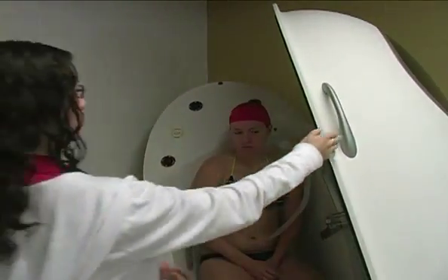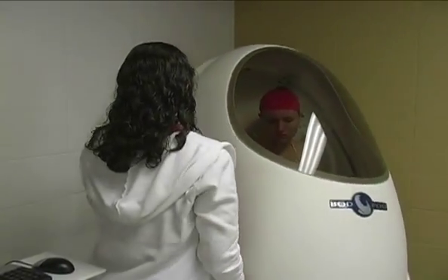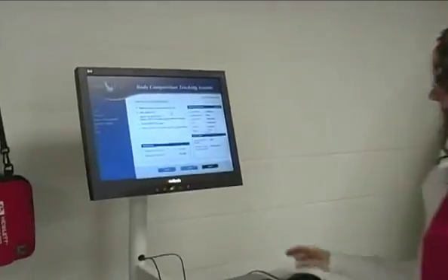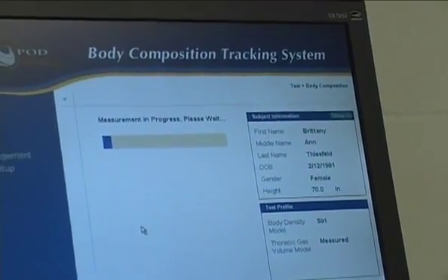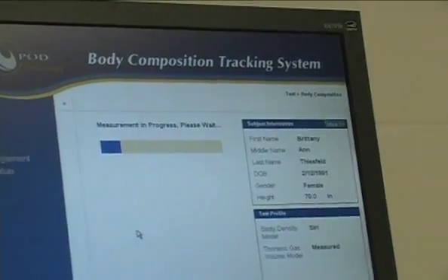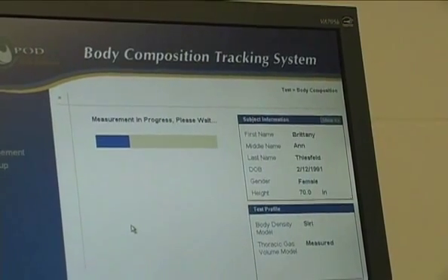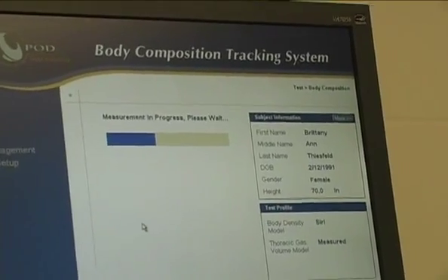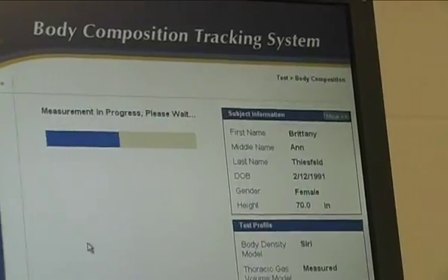So they've entered, and now we close the door. There's a lot of room in there, really. And then click next. You've probably been in a smart car. So this is the first volume test. Again, similar to when it was empty, it's 50 seconds, and similar to when we had the cylinder in there. Those are those valves opening and closing.